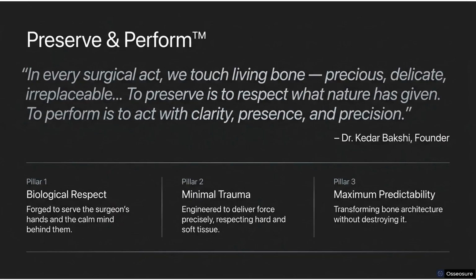Every implant dentist faces three pain points in daily practice. The first pain point is a traumatic extraction. It is very challenging to extract a badly broken down root canal treated tooth, especially when it is broken down at bone level. Extracting without destroying the buccal bone becomes a real challenge.